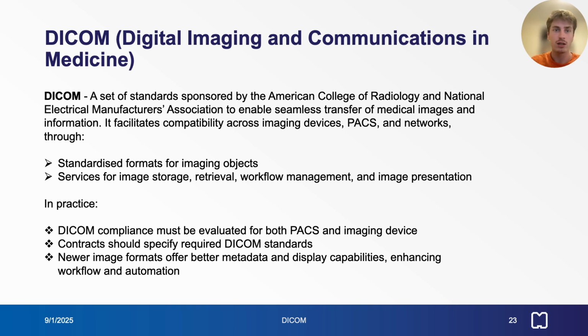In practice, DICOM compliance must be evaluated for both PACS and imaging devices. Contracts should specify the required DICOM standards. And newer image formats offer better metadata and display capabilities, which enhance the workflow and automation in a hospital.